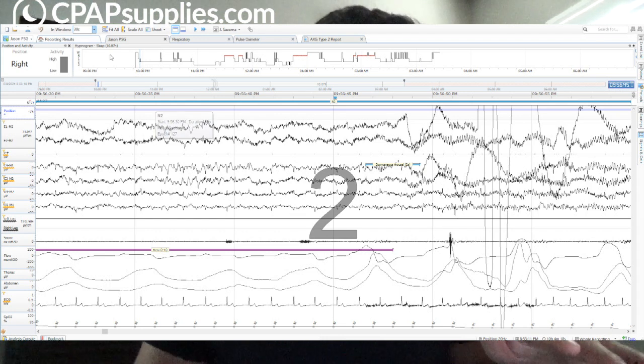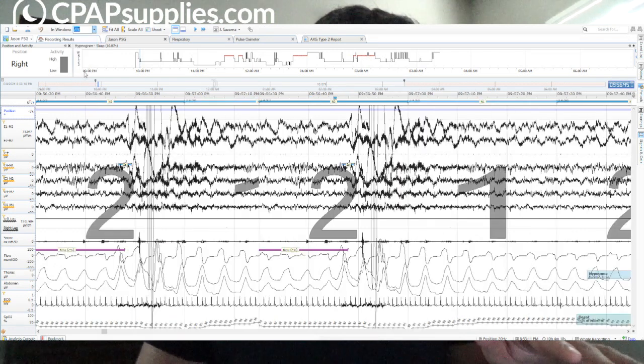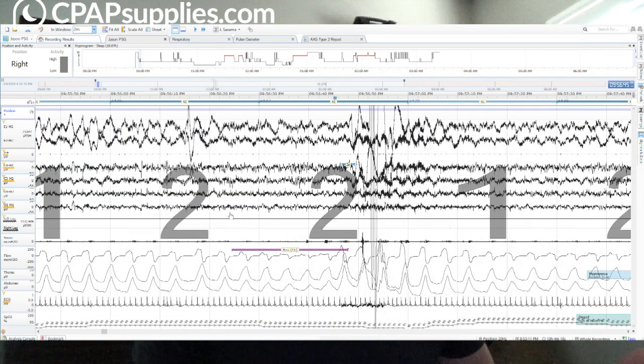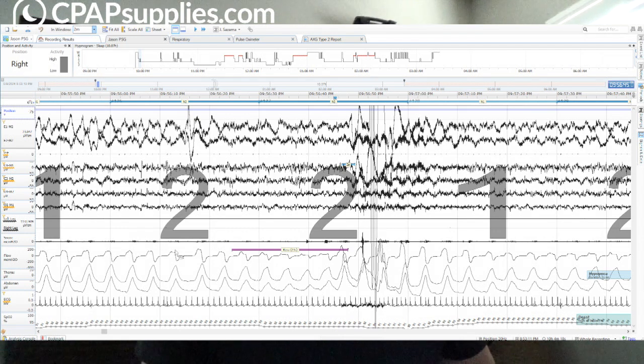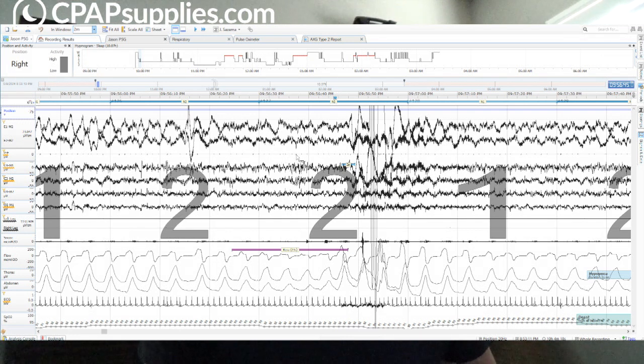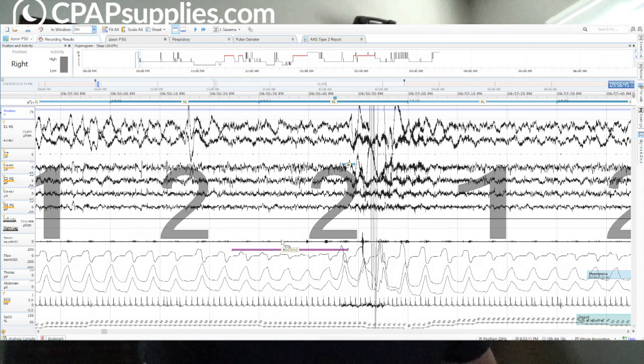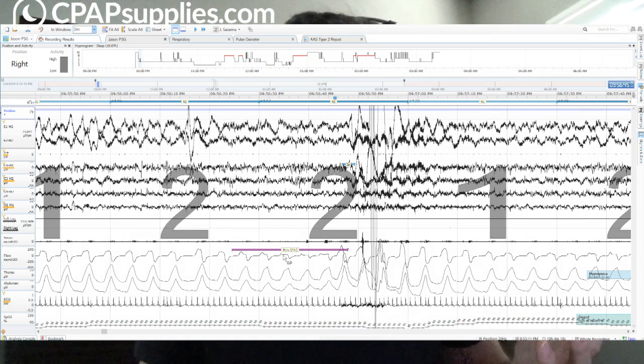If I were to shift this to a two-minute window, we can see it a little bit better. So what we have is a decrease in the airflow, the breathing. Let me go over those real quick. These top two here, eyes. We have the chin. These four are EEG, meaning your brain activity. We have legs, leg movements. We have snoring right here. We have flow, which is breathing. So if you're using Oscar, that's the only signal you really see.